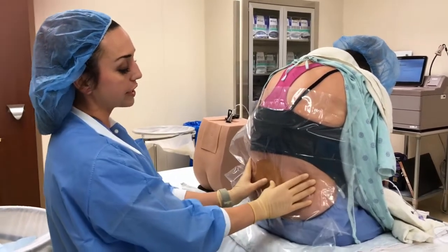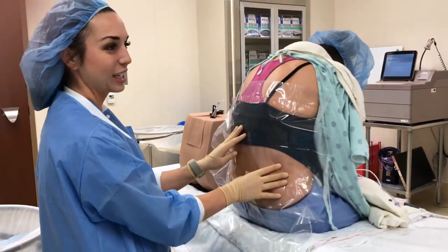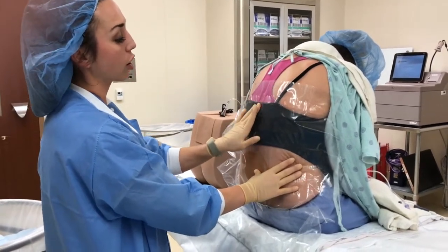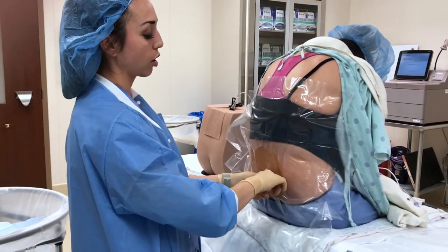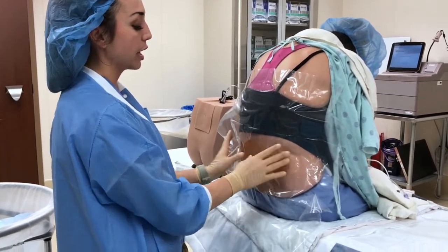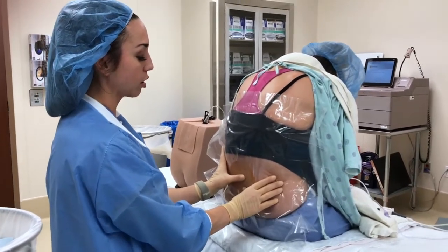Obviously in her case you can see and feel exactly where the spinous process is, but if you need help you can always start up higher and trace the back. L2-3, L3-4, L4-5 are all appropriate, but again, you're at risk the higher you go of encountering the spinal cord. So usually L3-4 and L4-5 are going to be your safe spaces.